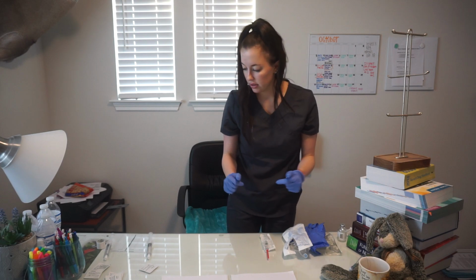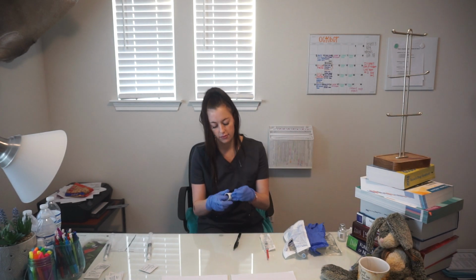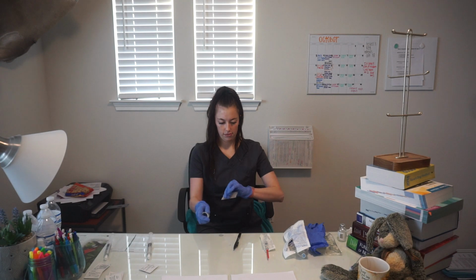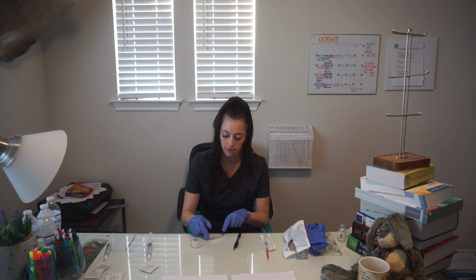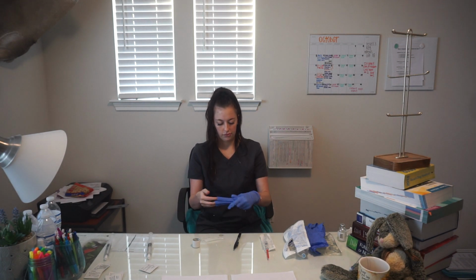Alrighty. I'm also going to make my drug labels really quick. I have labetalol, 4 mLs, with the date and time as well.